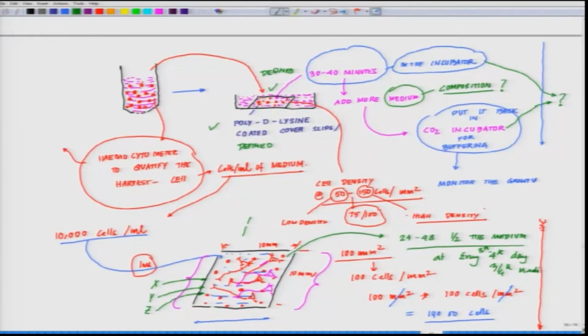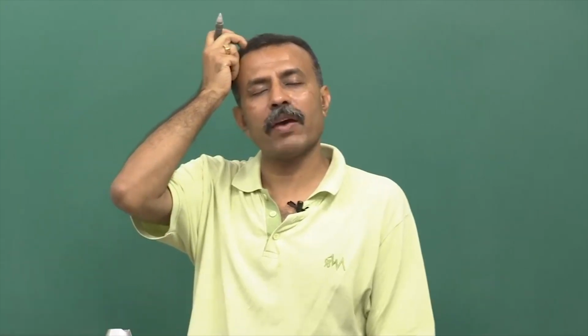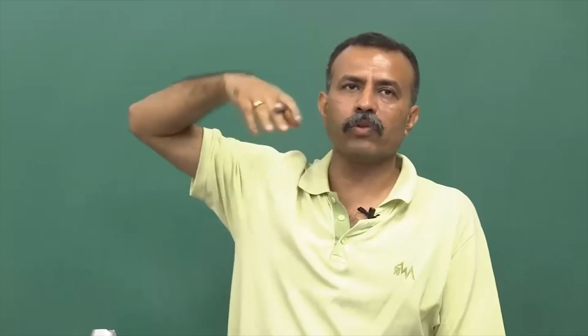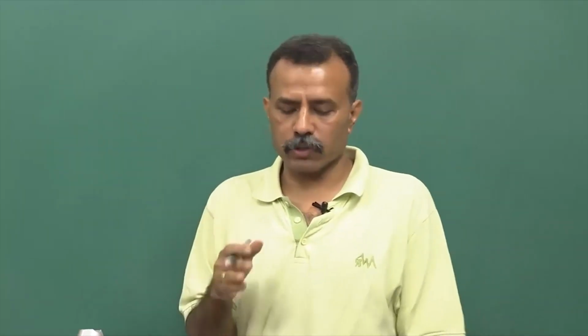Some people completely change the medium, which I do not fully recommend, because the cells secrete a lot of factors which are helpful for their survival. If you remove everything, the cells are devoid and have to redo the whole exercise. So, I would say change 3/4 of the medium every 4th day.